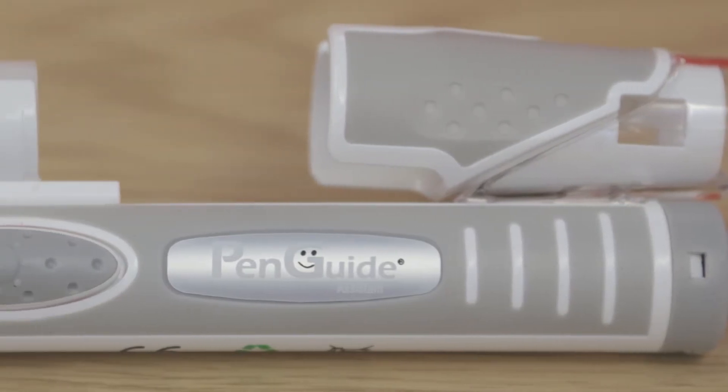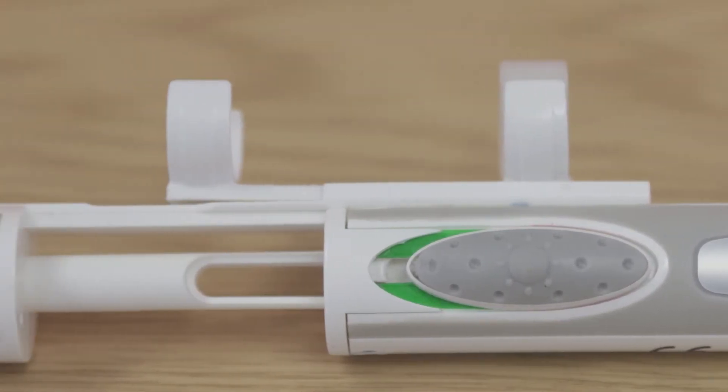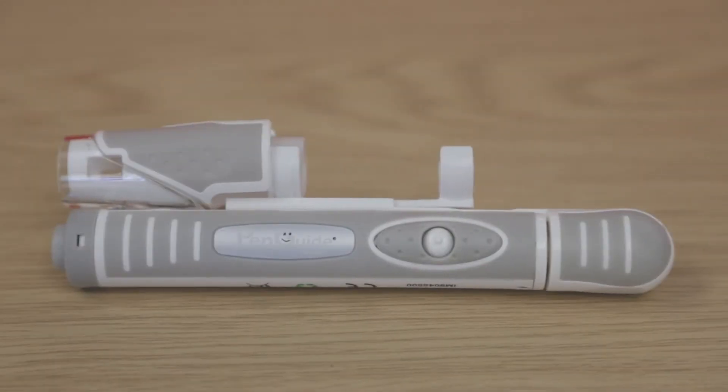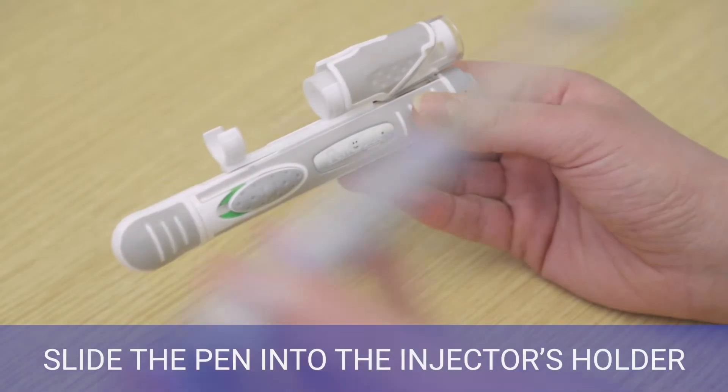It is recommended by doctors and nurses worldwide and is compatible with a wide range of pens and syringes. The Penguide Assistant is simple to use and can be reused every time you need to inject.